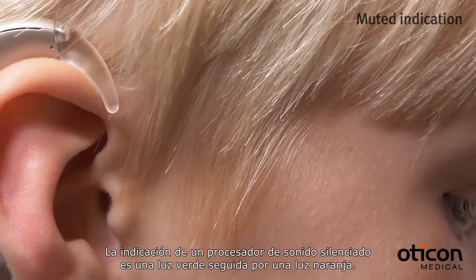The indication for a muted sound processor is a green light followed by an orange light.